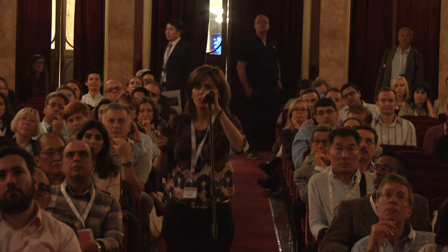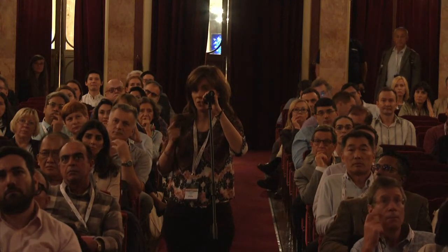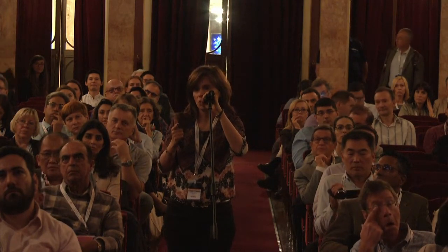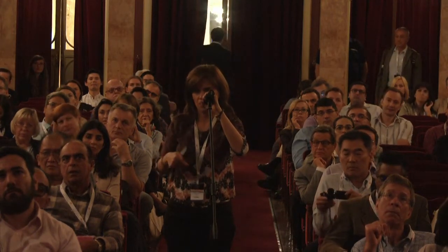One question. Would you choose this technique when you have atrophy of the choroid and you see the sclera down, or would you choose this for every break in high myopia? Because I found this really useful when you cannot do laser because you don't have choroid in the atrophy. Yeah, we have used it in the atrophy. Yes, all 9 cases had the perichoroidal atrophy, posterior atrophy, and posterior retinal breaks. We know that laser with RPE atrophy has no effect.